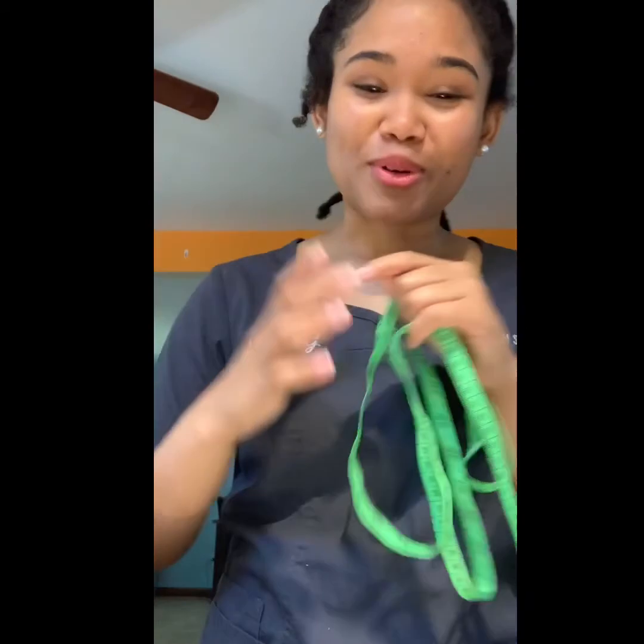And here is the cloth I will be putting on the scale to make sure that the baby isn't cold when I place the baby on the scale. And here's my disposable measuring tape.